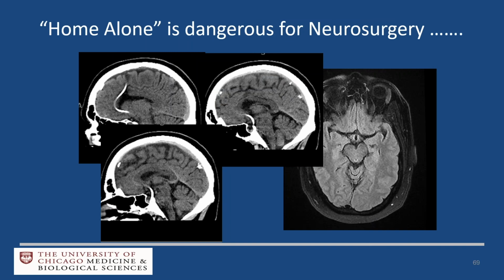And this is what you don't want to do. This is a patient that came from the outside with idiopathic intracranial hypertension. A shunt was placed. The shunt actually worked. As you can see, you can drain CSF also from the suprasellar cistern, but the patient had a classic postoperative bitemporal defect. And as you can see on the MRI scan on the right, the trajectory of the shunt, which is way, way too long, went straight through the chiasm. So if you use intraop CT, this should not happen.